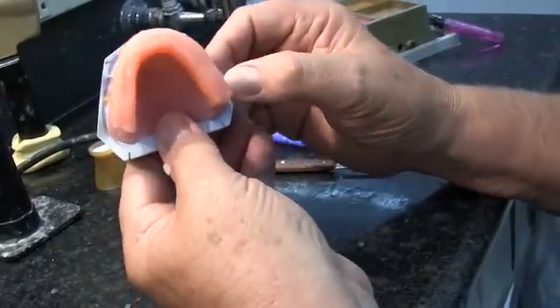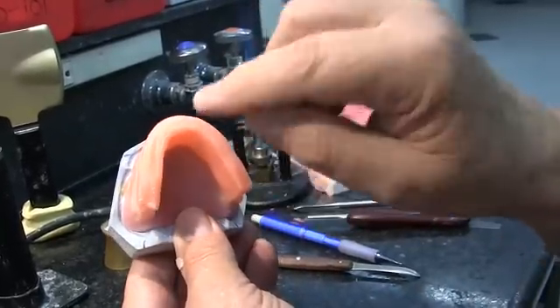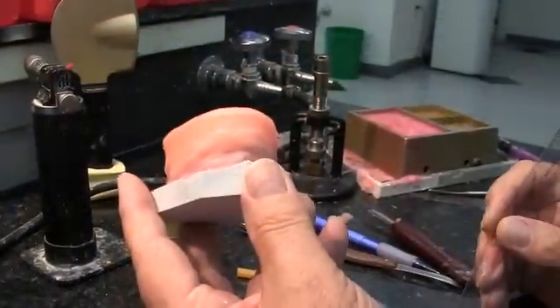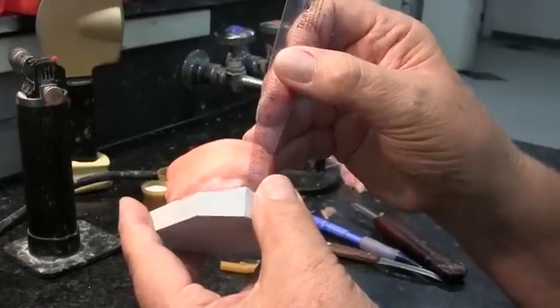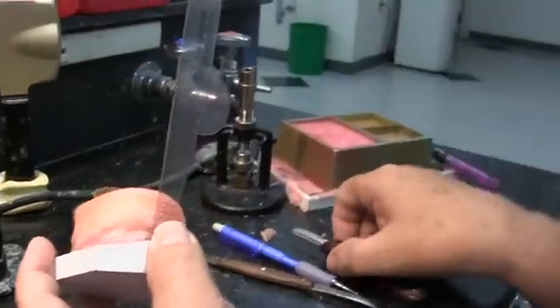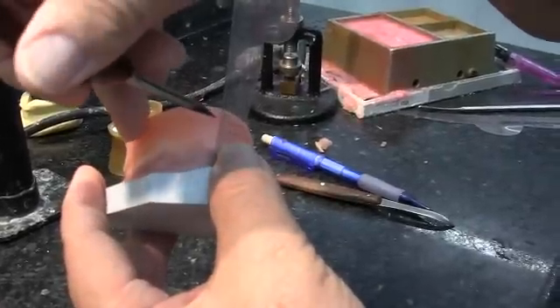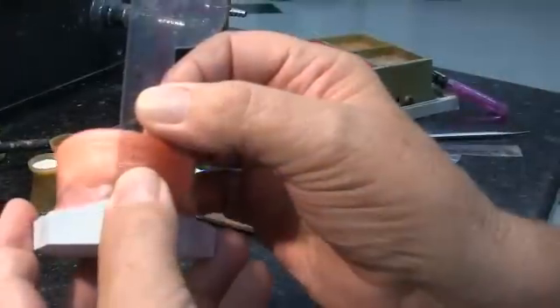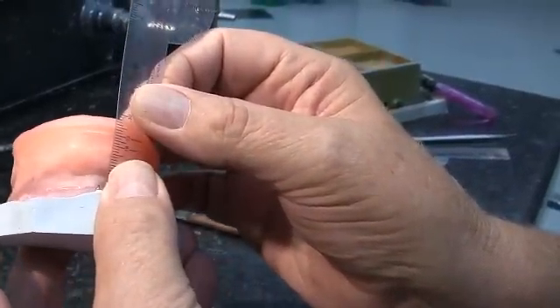Now we're in pretty good shape. We're checking to make sure we're over the center of the ridges and that we are approximately 6 millimeters to the anterior. We are now ready to measure the anterior height of the occlusion rim — we want it to be 22 millimeters from the depth of the vestibule, measured 1 to 2 millimeters either side of the anterior frenum. We've placed a mark on there.